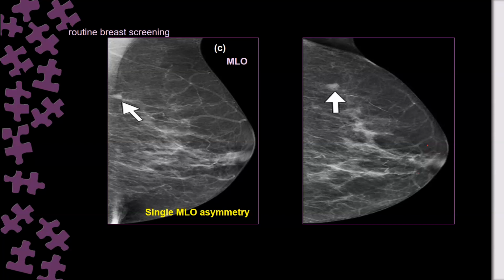That is why I told you, from experience you will learn. The management of each different case is unique. You cannot follow the same rule for all the cases. And from your practice, you will learn to minimize the radiation for the patient. We don't like to do many views. Just try to select which view can help you in the workup of this case.